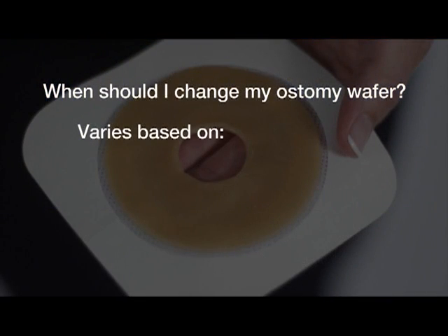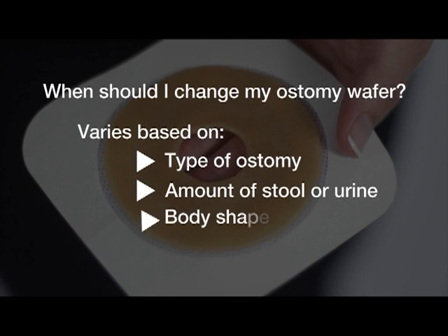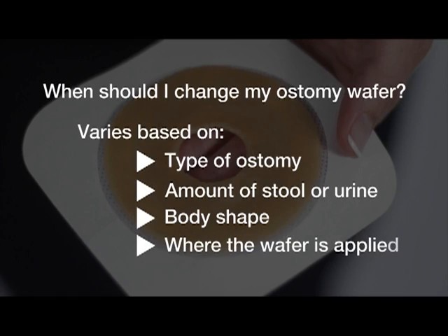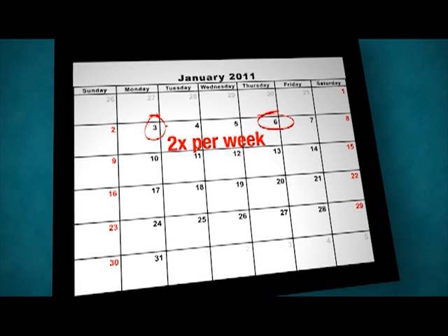This varies based on type of ostomy, type and amount of stool or urine, and your general body shape where the wafer is applied. In general, most people change the wafer twice per week. Always change your ostomy system if you experience leakage.